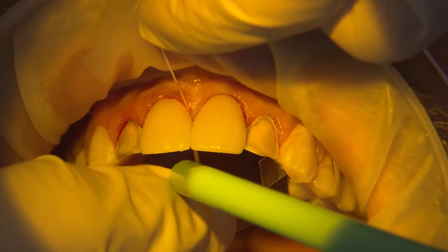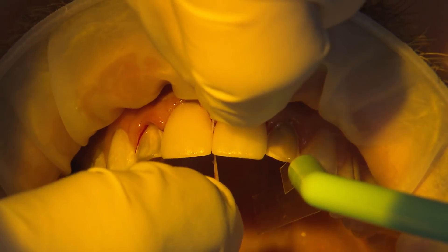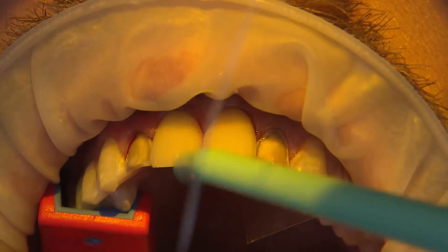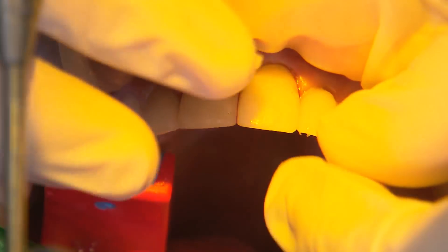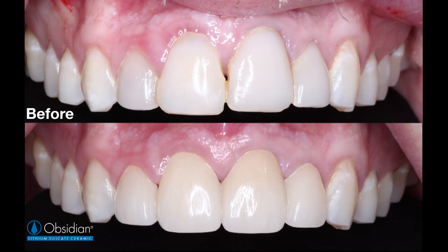Once the veneers are fully seated, we tack cure along the gingival margins to accelerate the cement to a gel state to aid with removal. After most of the cement is removed along the gingival margins and lingual, we polymerize these areas more so they can help hold the veneers in place during the interproximal removal, which is usually the most challenging area. We repeat this same process on the laterals. The patient was extremely happy with the final results, as the Obsidian lithium silicate veneers provided a much more natural appearance over the old composite restorations and blended in very well with the rest of his natural dentition.